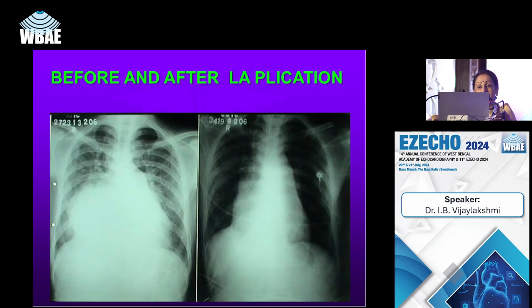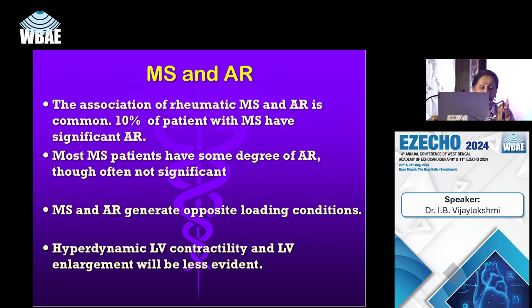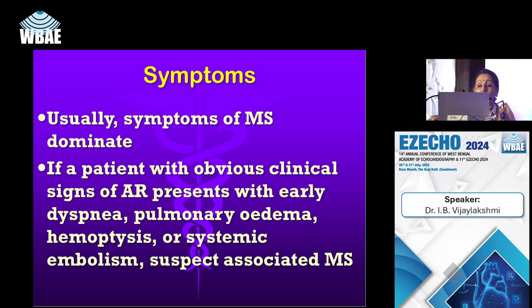All quantification methods to assess severity of the valvular lesions have limitations. They combine a number of measurements, therefore their use requires experience and integration of a number of measurements rather than reliance on a single parameter. So take-home measures: diagnosis of the severity of the valve lesion by clinical examination is very important. Do not rely upon one parameter. Specify assessment of the mitral, mild or significant lesion. Echocardiography and Doppler evaluation is the gold standard.